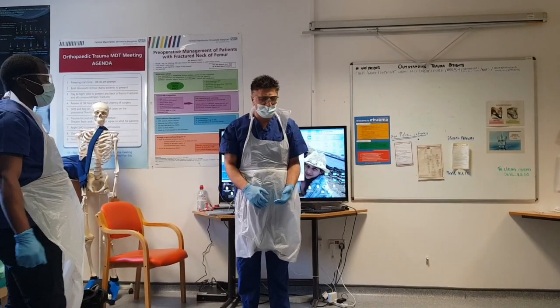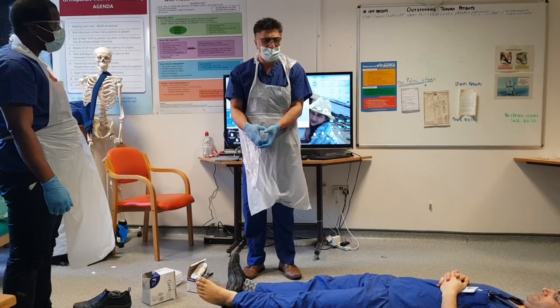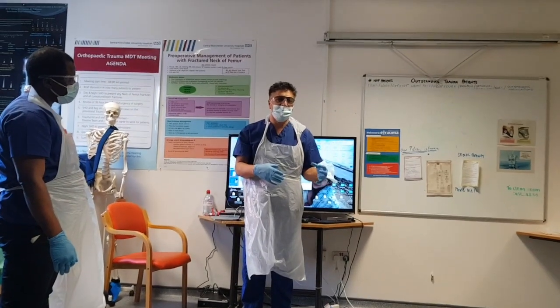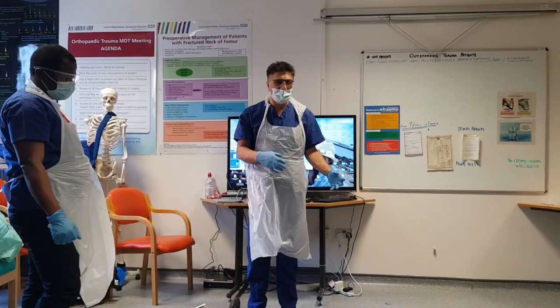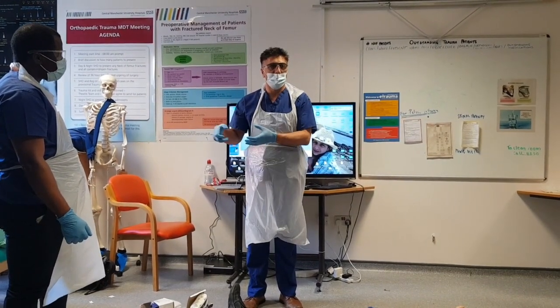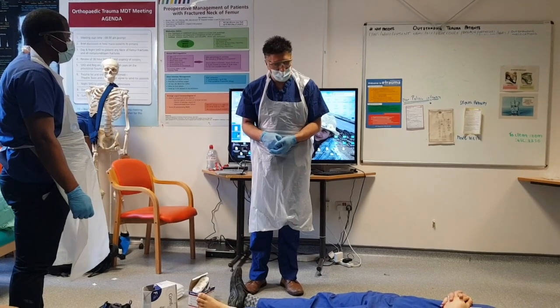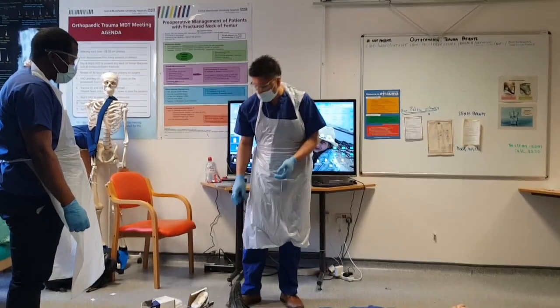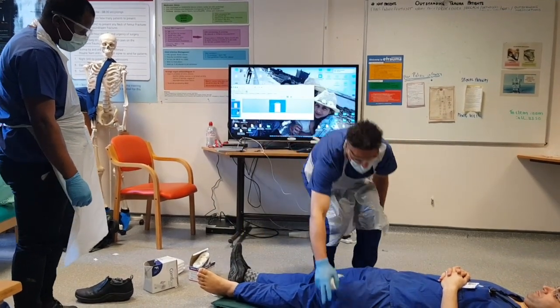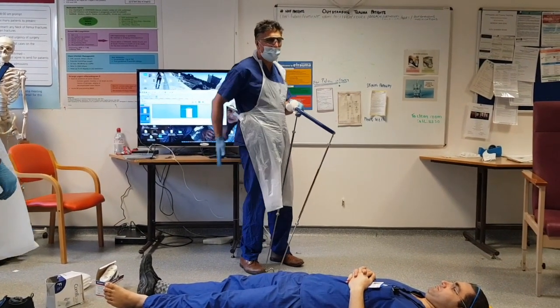In order to get the reduction, we're going to get someone to put in-line traction on the patient's leg. And if you can tilt the head slightly downwards, what that means is that the patient's body is going to give you counter-traction because it's sliding the other way, so that you can hold onto the leg and pull backwards and you're not just going to pull the whole body up. First of all, we're going to wrap a little bit of wool around the bar that's going to go over the ischial tuberosity — that's the bit of your bottom that you sit on.